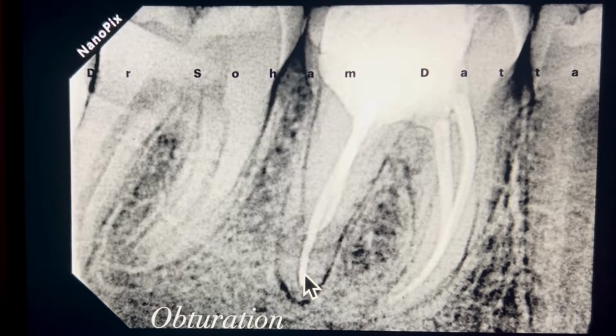Now in this obturation radiograph, you will see that the length of the extra root, that is the distolingual root, is way shorter than that of your distobuccal root. This is a distobuccal root here, that is a 36 GP.